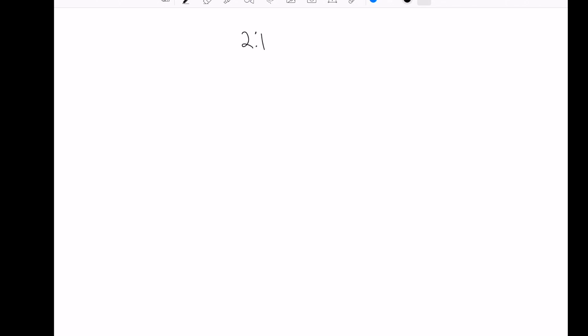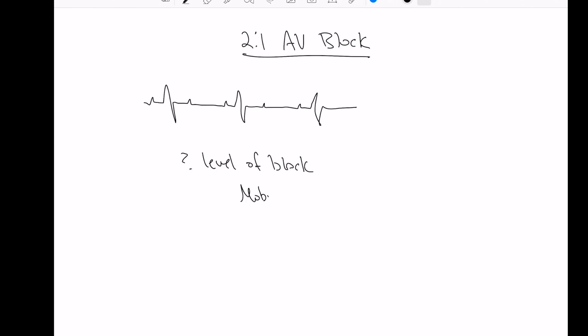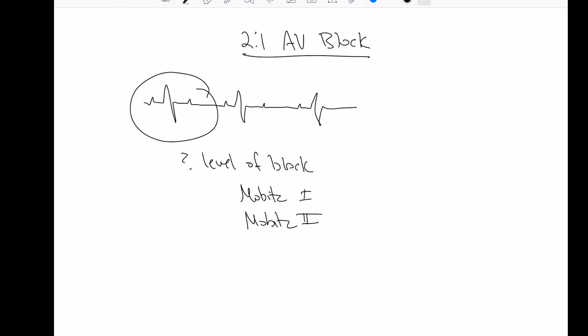Real quick about 2-to-1 AV block. 2-to-1 AV block is when you have two P waves for every QRS, so that means every other P wave does not conduct a QRS and you get a dropped beat. Now, this becomes questionable about the level of block. Is it a Mobitz 1 or a Mobitz 2? Because there's every other beat that's dropped, you don't have enough cycles to see could there be prolongation of the PR interval. And it's tempted to call this Mobitz 2, but technically we can't be sure of that.